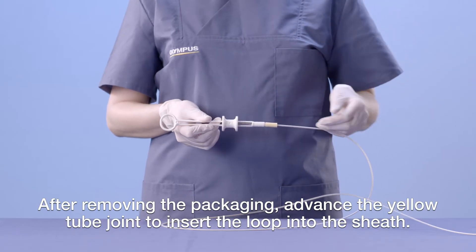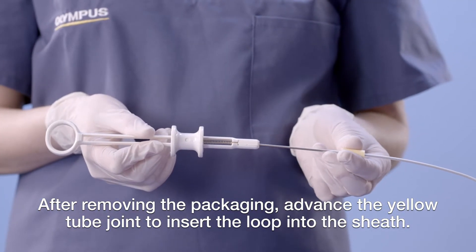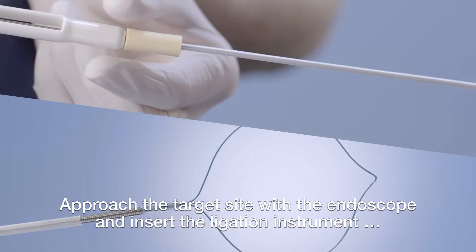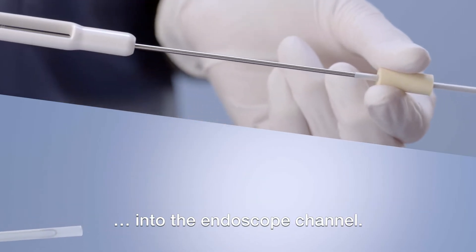After removing the packaging, advance the yellow tube joint to insert the loop into the sheath. Approach the target site with the endoscope and insert the ligation instrument into the endoscope channel.